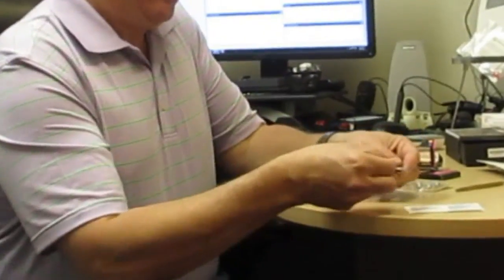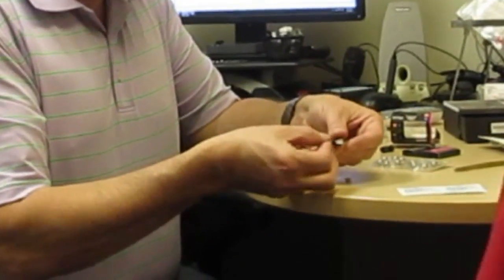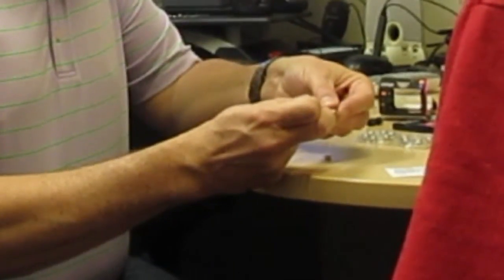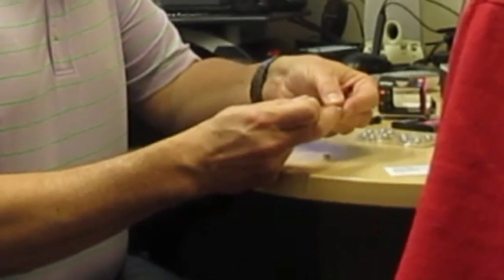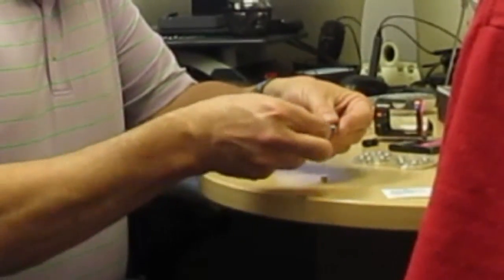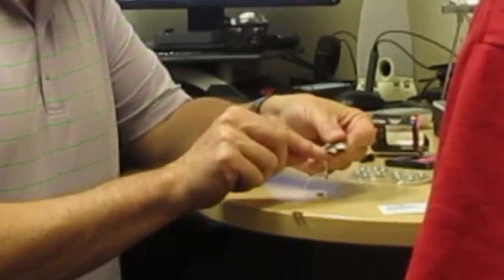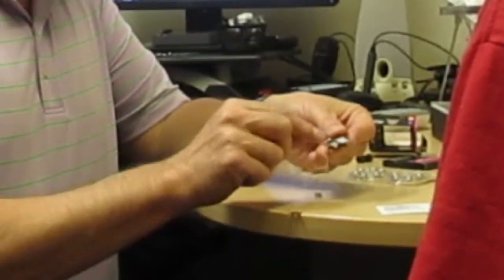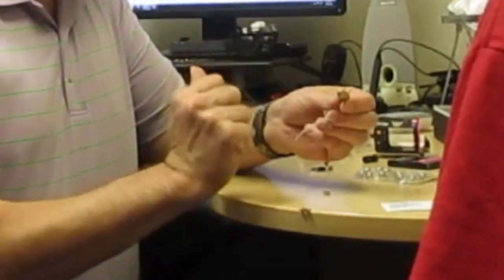So we put the battery in the hearing aid into the little door here. The door opens up towards the wire from the bottom, comes to a stop here and then opens. The battery will go flat side up — plus side — that's the positive side of the battery, and you notice there's also a little plus, very small, on the door. Then you'll close that battery door.